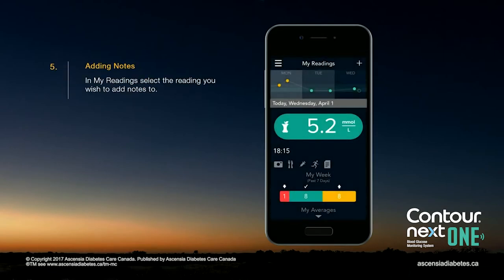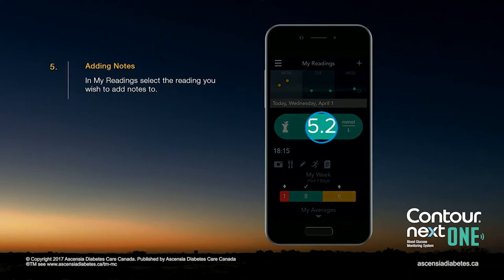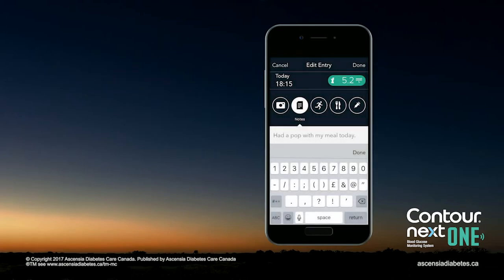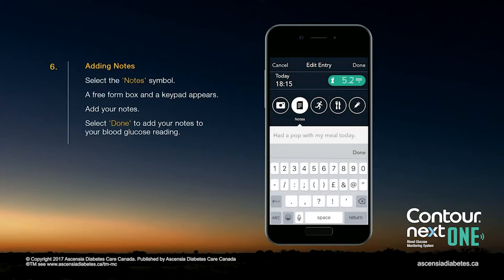In the My Readings, select the reading you wish to add notes to. Select the Notes symbol. A free-form box and keypad appears.